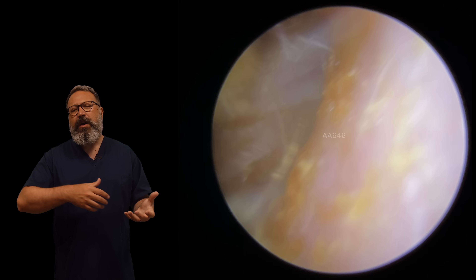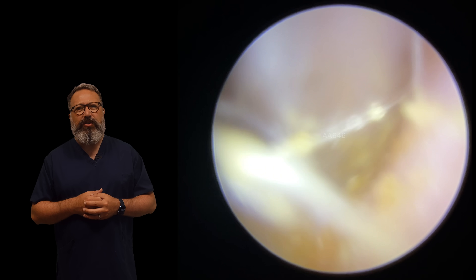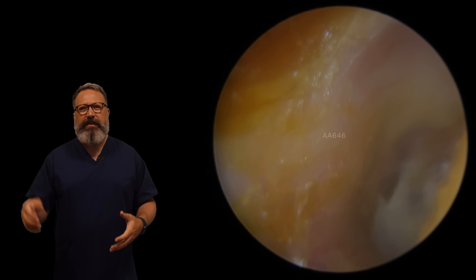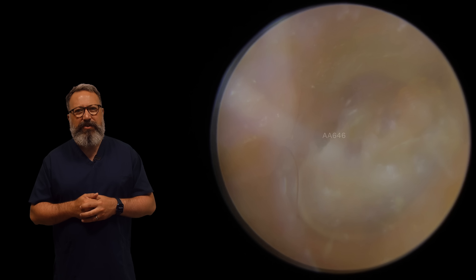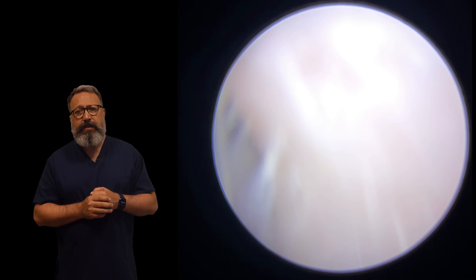So this is sort of past trauma - old scar tissue rather than there being anything new we need to worry about at the moment. I'm just giving it a little bit of a tidy up around the outside edge. You can see what I mean about it looking quite milky.